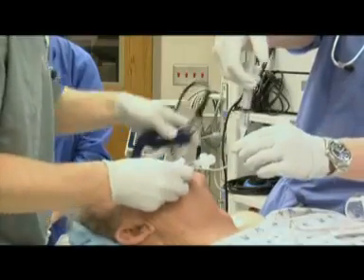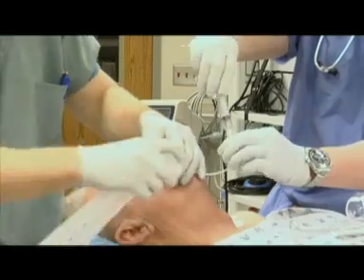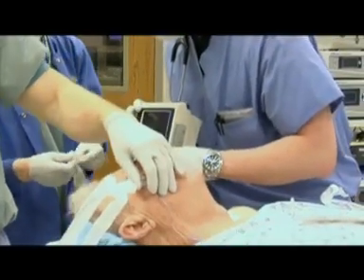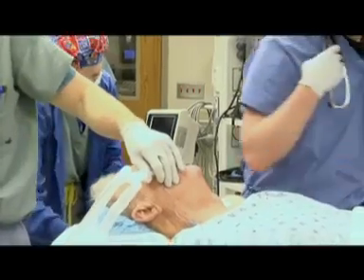The endotracheal tube cuff is inflated using minimal occlusive pressure. The airway circuit is connected, and confirmatory breath sounds are auscultated over each lung, while noting the end-tidal carbon dioxide on the patient monitor.